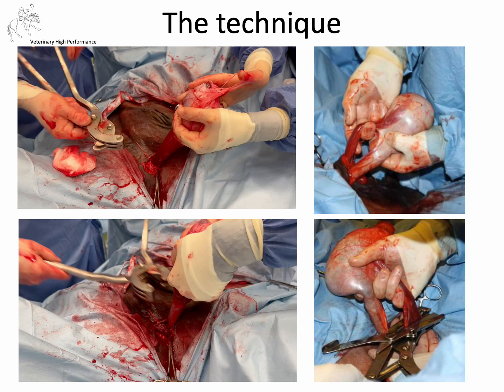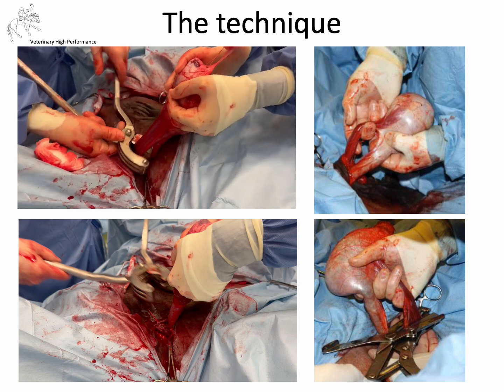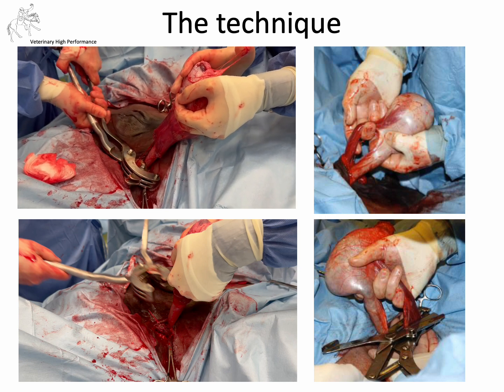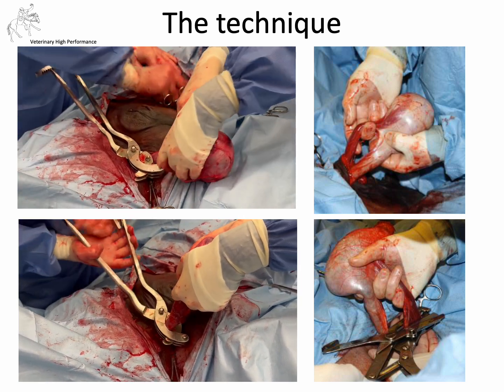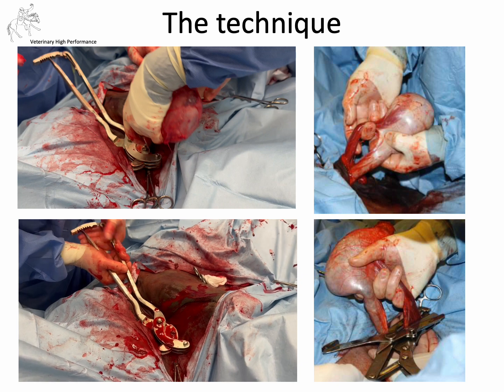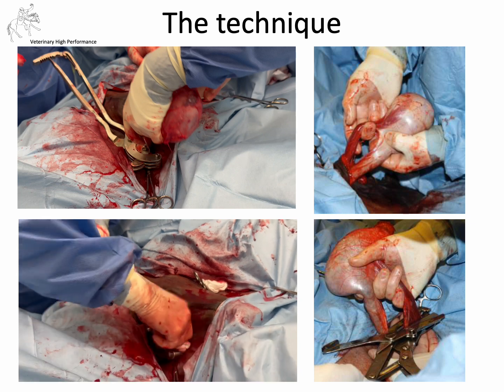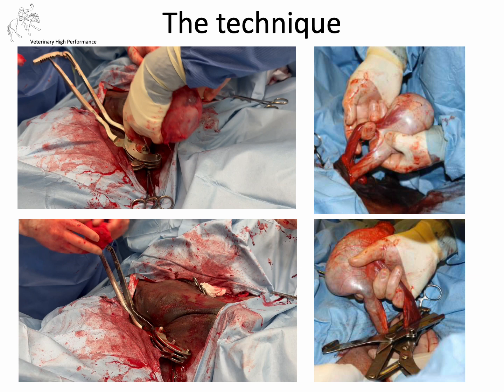Just to run through those steps again: we emasculate having placed a ligature on both the cremaster muscle individually and the cord. When we do that, we go about a finger's breadth — one centimetre — above where the ligature was placed, which gives us excellent hemostasis. Leave the emasculator in place for a minimum of one minute on the spermatic cord, maybe a little longer. It used to be said a minute per year of the horse's life, but for older stallions, at least two minutes is usually what I would opt for.